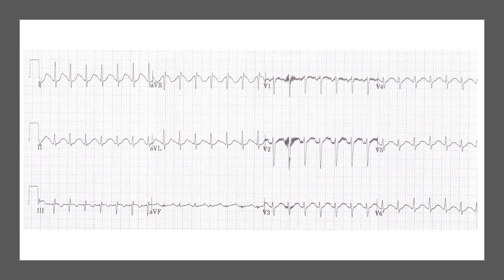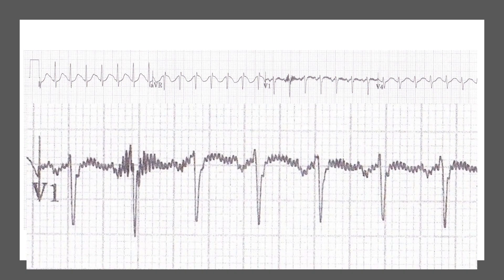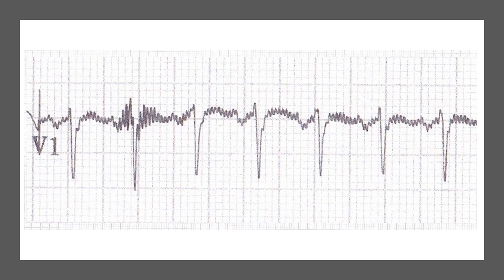Let's go back to our ECG and apply this tip. We're looking at narrow complex regular tachycardia — SVT versus flutter versus sinus tachycardia — and there are no clear P waves anywhere. But if we focus on V1 and make it bigger, we can see that there is a regular deflection happening before each complex. That's the P wave. There is only one P wave before each complex in V1, which means this was a sinus tachycardia case.